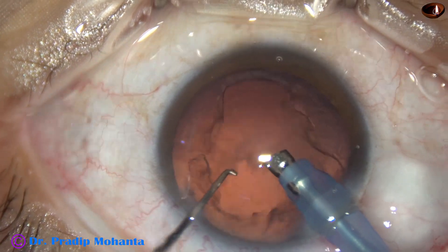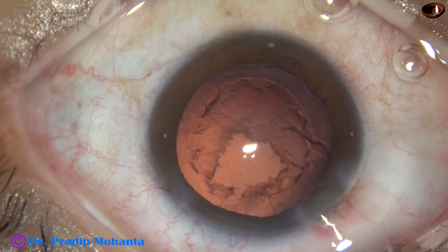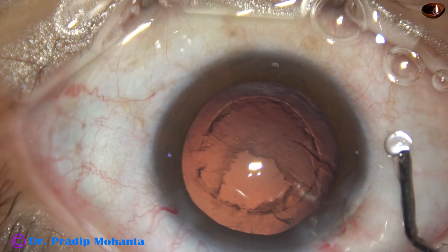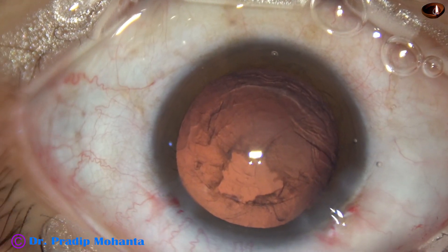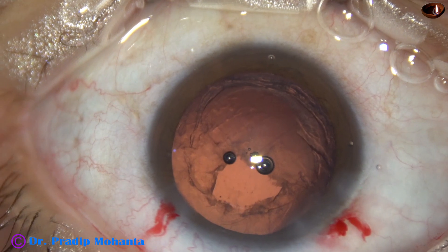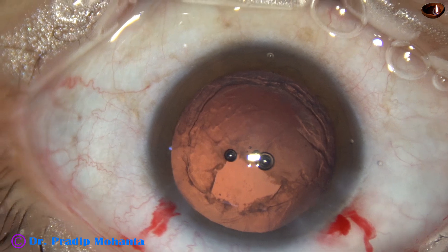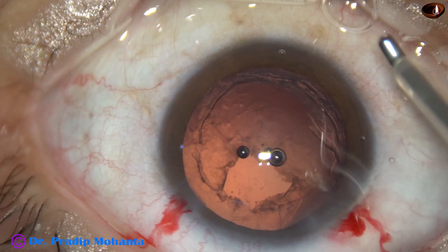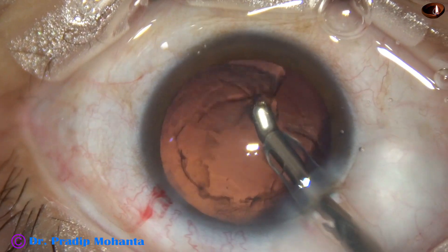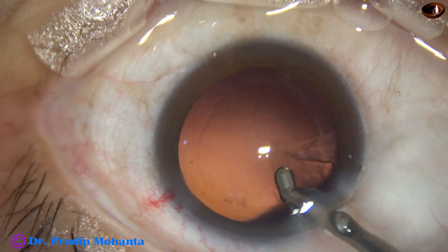And now the rest of the lens matter is removed. Cortical cleanup is to be done. In this case, I am using a coaxial irrigation-aspiration device from Oatly for this. With this coaxial IA, the removal is really fast.